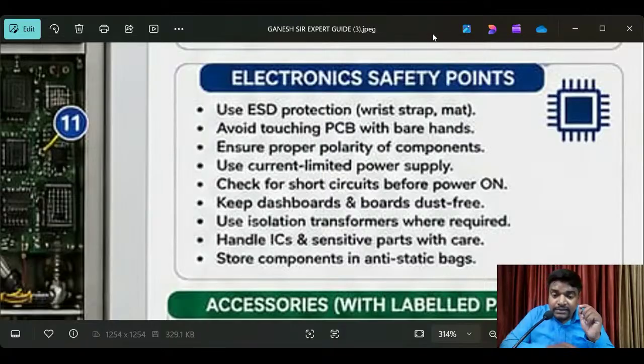Understand? As a biomedical engineer, first of all you have to focus on safety precautions, not on resolving the issues. Because of safety precautions: what is the highly dangerous component? What is the low danger component? What is not dangerous at all? What are the components and what are the specifications for that purpose? I have given the proper explanation for electronic devices in my live sessions.